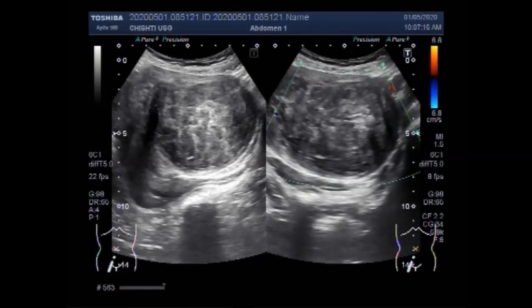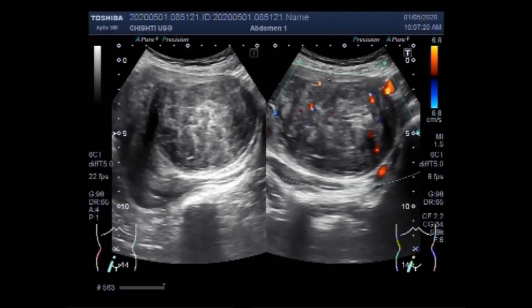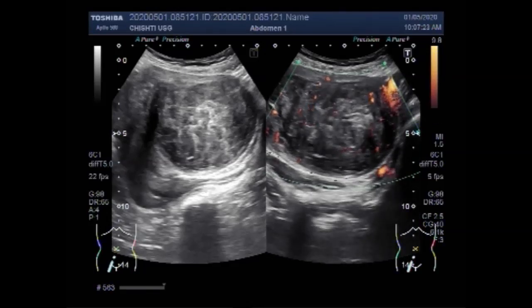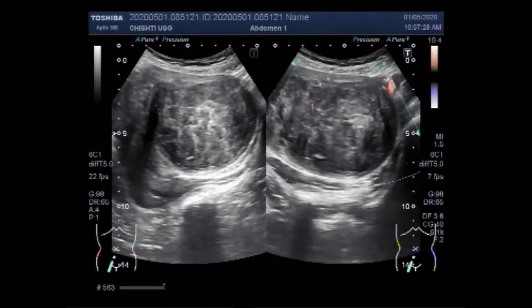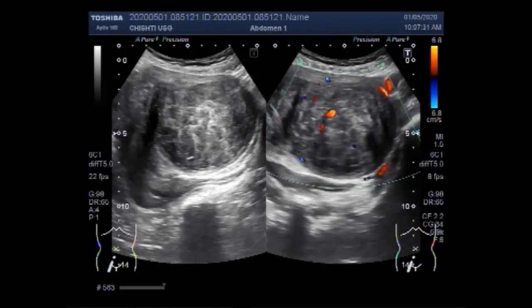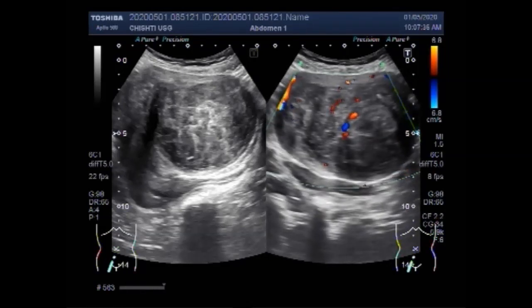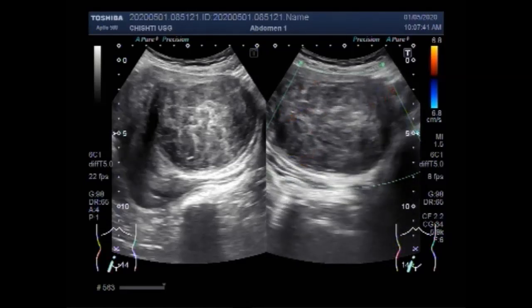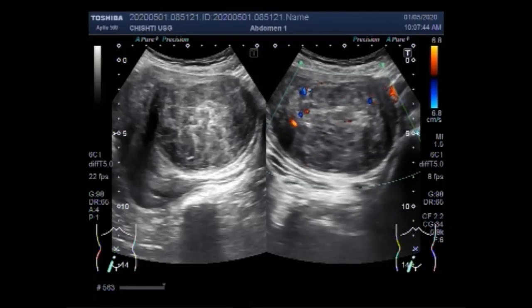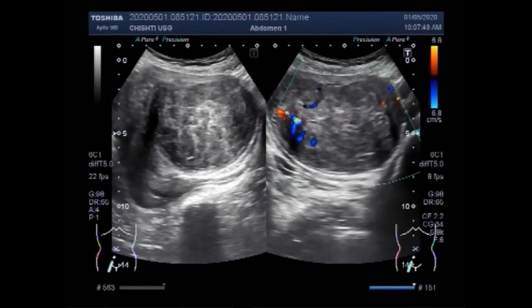Ovarian cancer can progress from early to advanced stages within a year. Paying attention to symptoms can help improve a woman's chances of being diagnosed and treated promptly. Detecting cancer while it is still in its earliest stages may help improve prognosis. You can see a significant blood flow is seen in this mass.